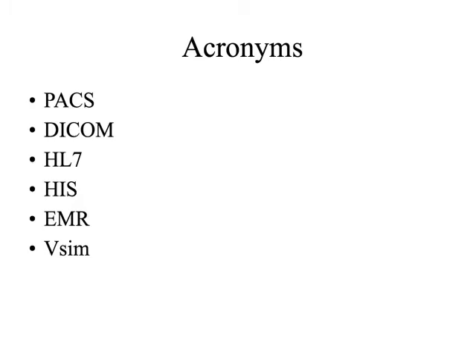The HL7 is another format that's important, and this is largely the format that communicates stuff to the CT scanner. So, for example, patient Smith shows up and the front desk person types in patient Smith, right, and misspells her name. Now the HL7 is going to communicate that to my CT scanner, and I'll be like, oh, okay, great, this is not right. That's the HL7 is what communicated from the front desk computer to my CT scanner.